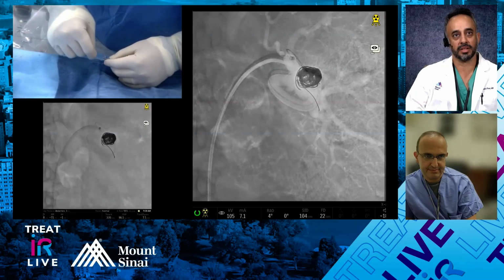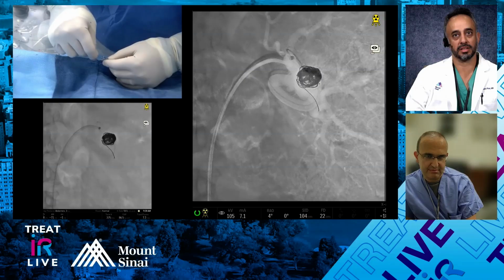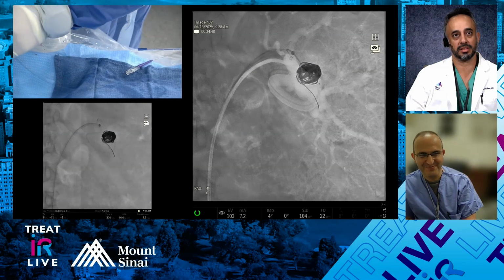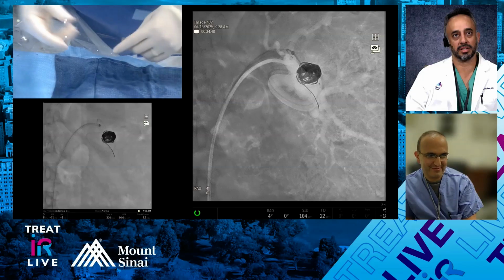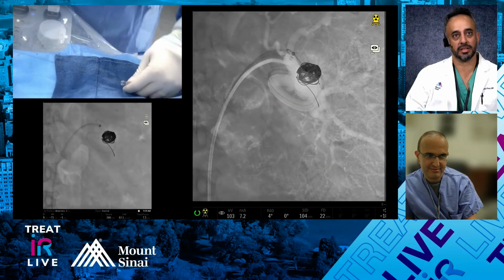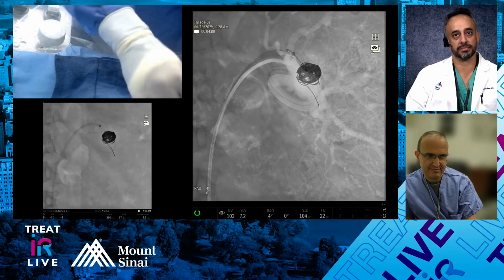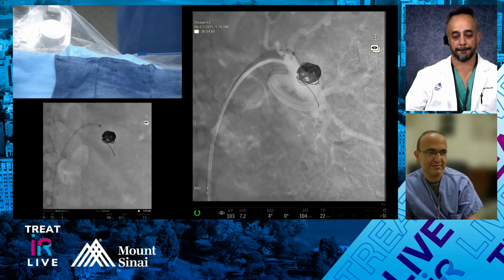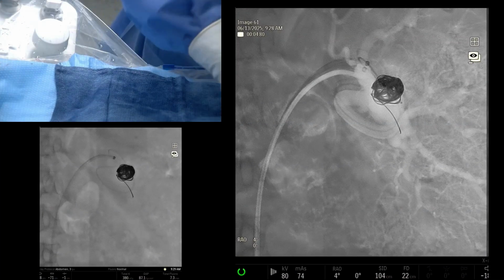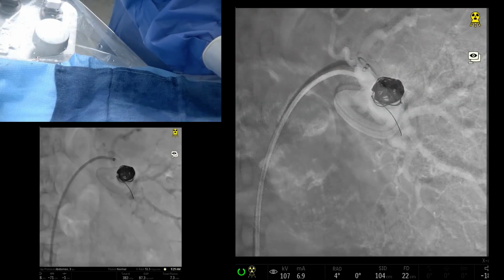You can see it's packing in quite nicely. Because I am also a little impatient, we can actually do a puff. We're not going to see anything, but just to take a peek. We're all, I think, by nature, a little impatient. So I'll just show you why we use the guide cap, because now we can puff and see exactly how much we've potentially occluded.